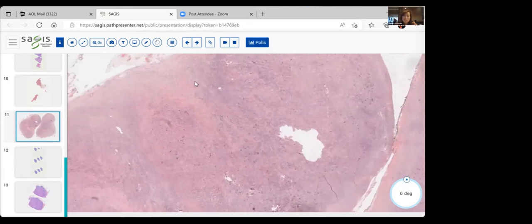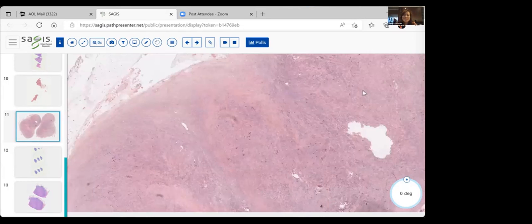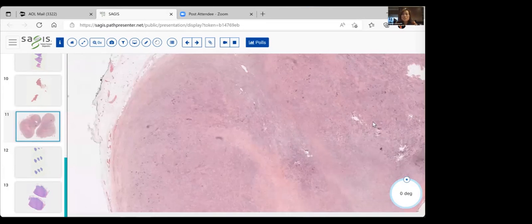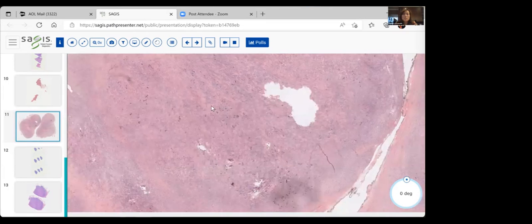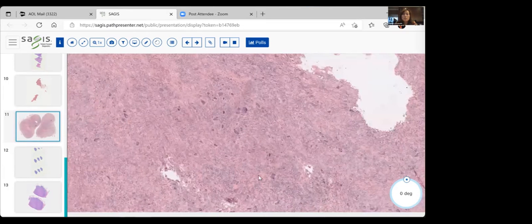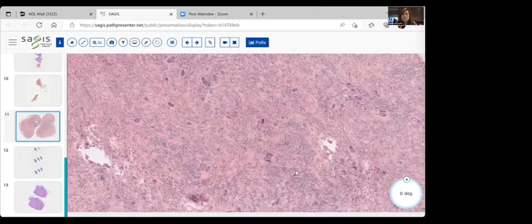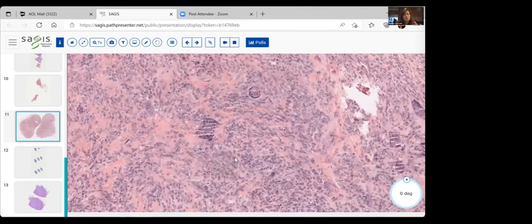And you can see that these mononuclear cells are scattered about, but again, intermixed amongst these cells are some larger cells. Let's take a look at these larger cells. Let's see, I want to look over here. See, they're coming up. See these larger cells? All right, let's go higher magnification and look at them. Now, I like these larger cells because if you look at the cells we looked at before, most of them have very smooth edges, like the foam cells, very smooth edges, or the multinucleate giant cell smooth edges.